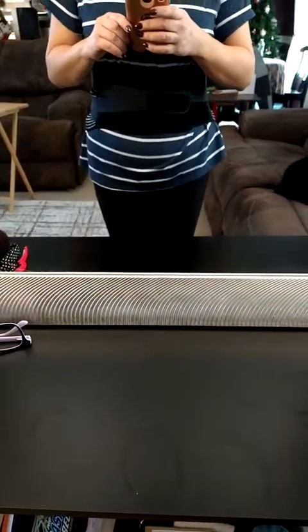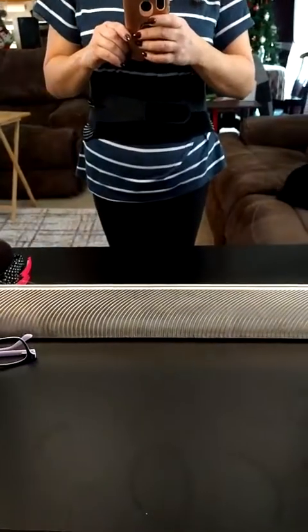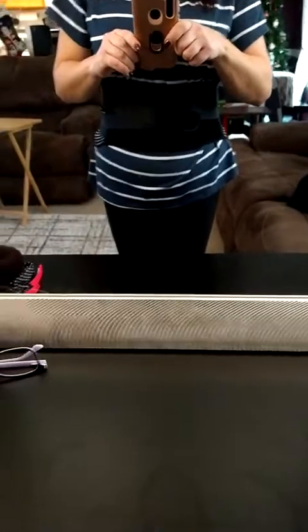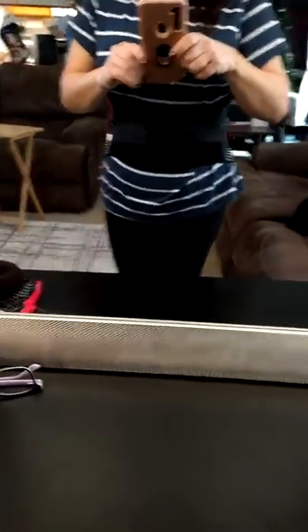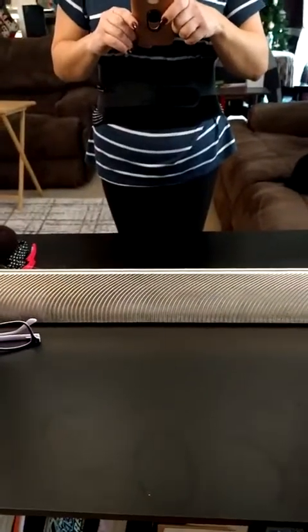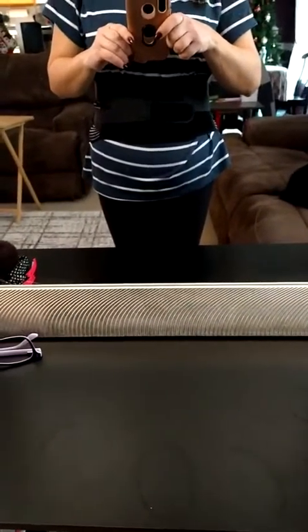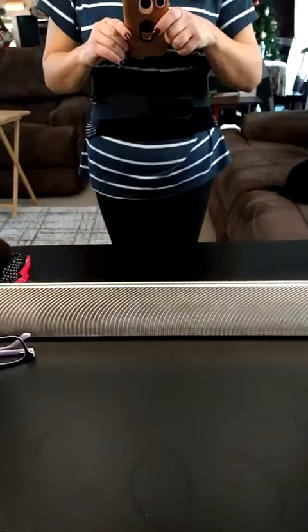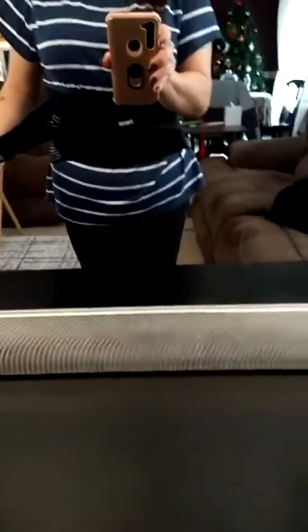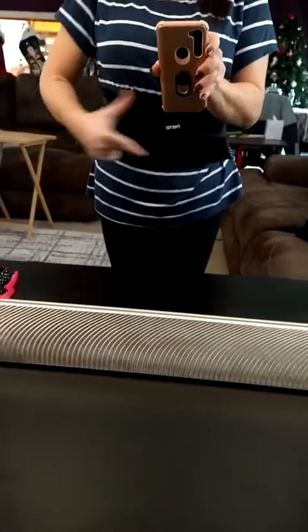I purchased this back brace because I do a lot of heavy lifting at work. This is one of the best purchases ever. I am currently 165 pounds, five foot three, and I ordered the large. It is extremely adjustable, which I love — you have these straps that you can tighten, and they go on the outside.